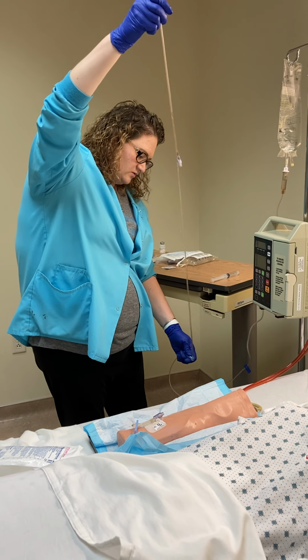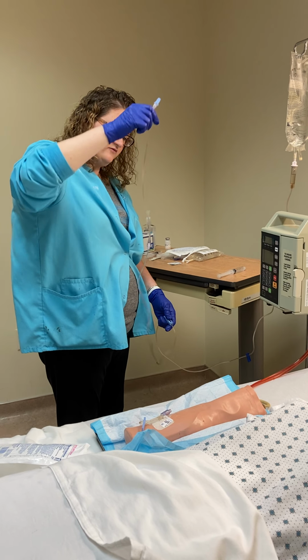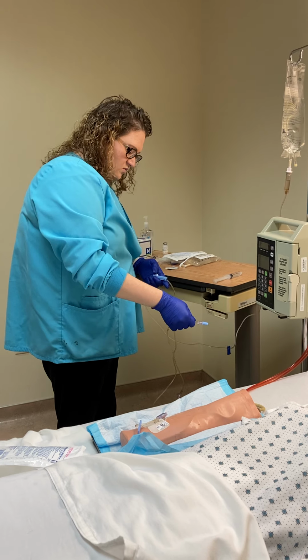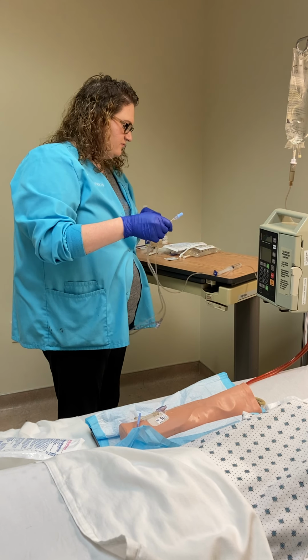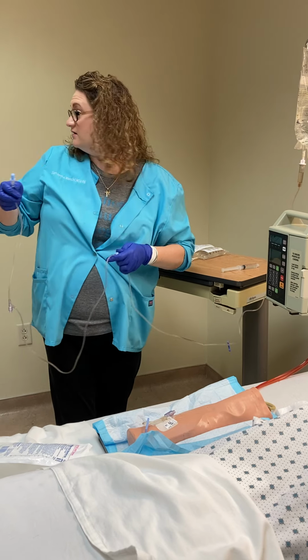Now, just so you know, when you're practicing, you're probably going to have more bubbles with each time that you practice because these are single use. In the clinical setting, you can prime into a sink or a trash can. In the med room usually is where I would hang it.